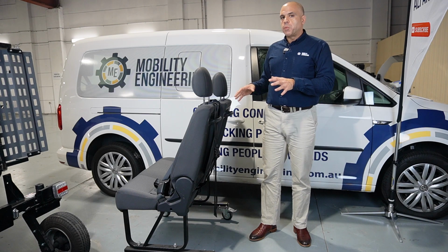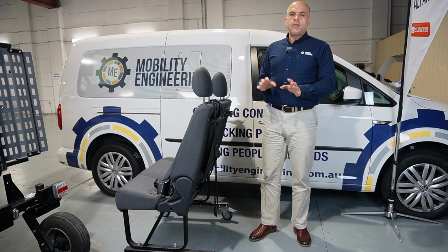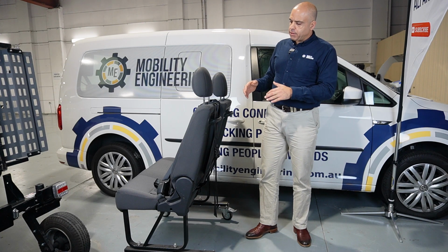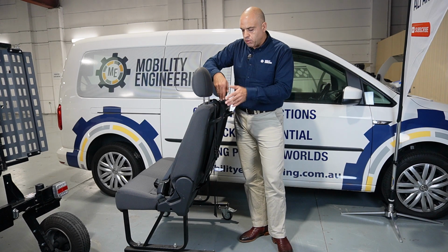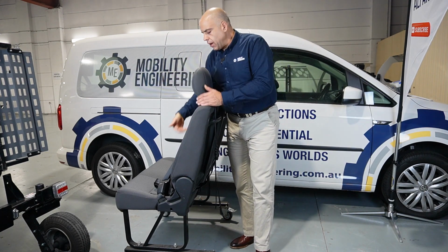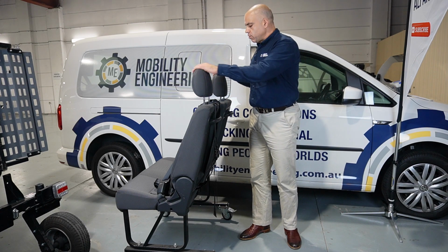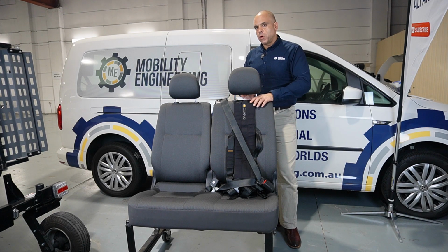In most cases you probably can't, but in some cases you actually can, and this is where you'll have to see a Mobility Engineering licensed installation agent, or a partner. In some vehicles, you can cut an access hole and put a nice smooth passage for the belts to run through, and then cut an access hole down the bottom there in that steel panel and run through, and make sure the straps can run all the way around the seat and the harness can work. So can it be done? It's possible. It requires some form of structural modification to the vehicle.